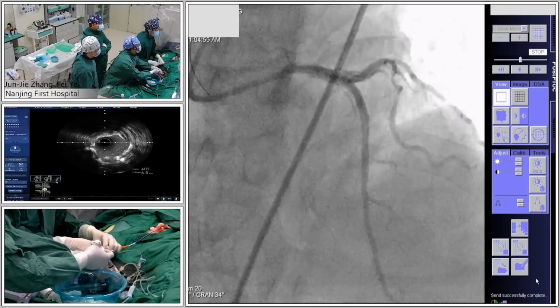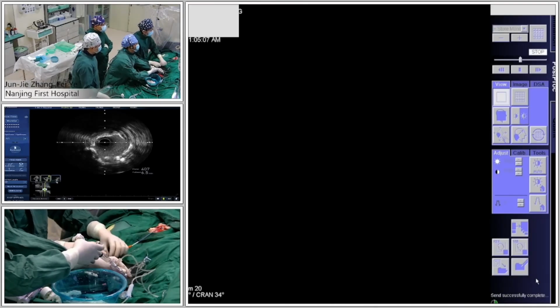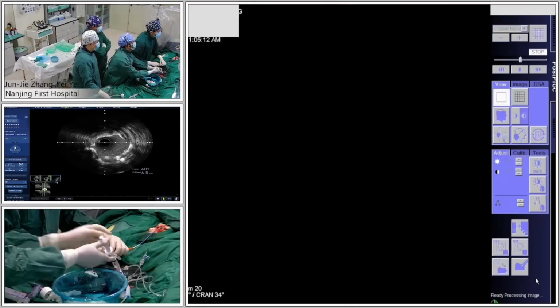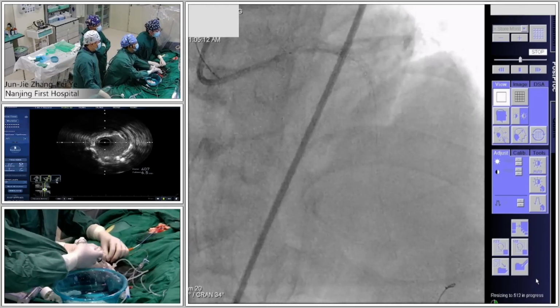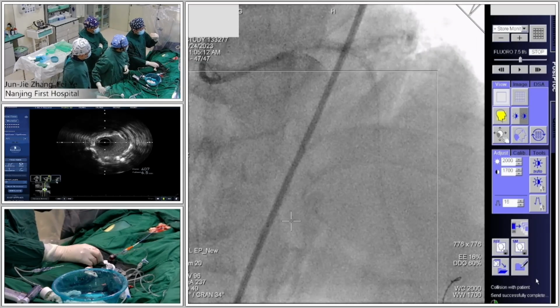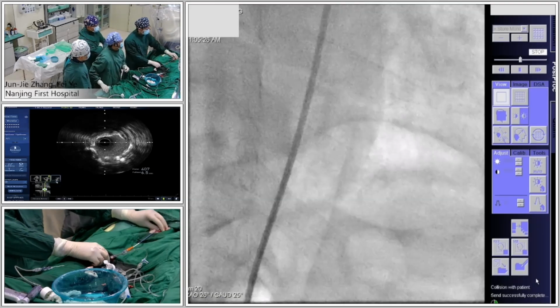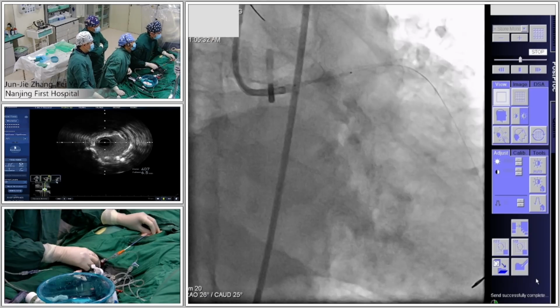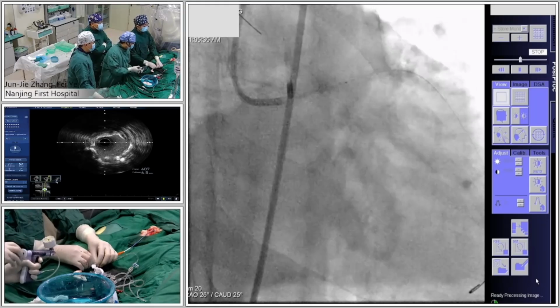Just test. Okay, seen it. I think here we have definitely full coverage. I need to push a little back. Yes, test for a while. Caudocranial. Okay, show the distal part of the cranial. We don't need the contrast only. Seen it. I think it's fully covered. Overlap. Up, up, 12.